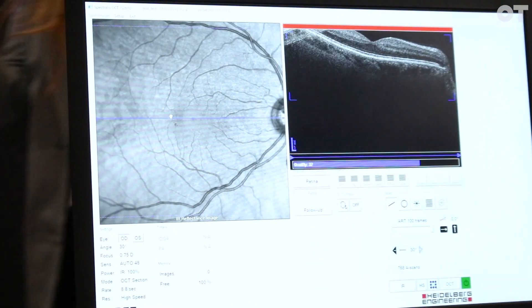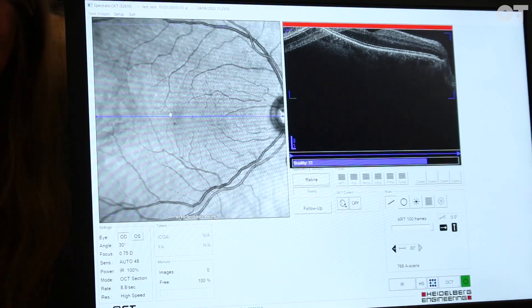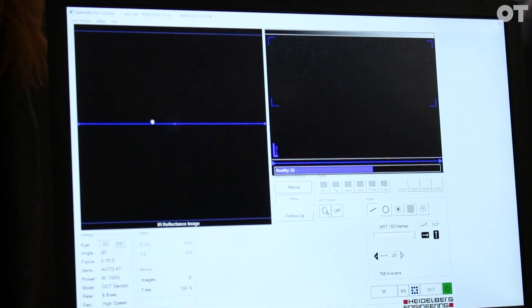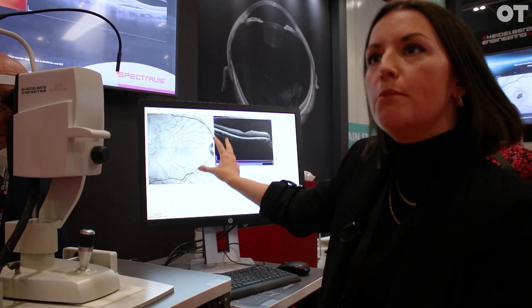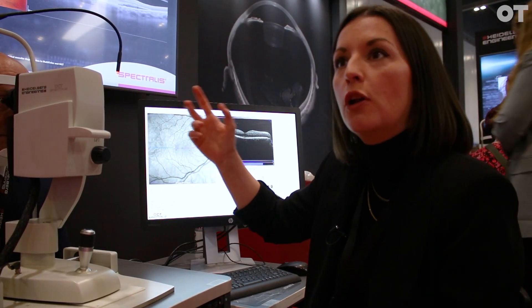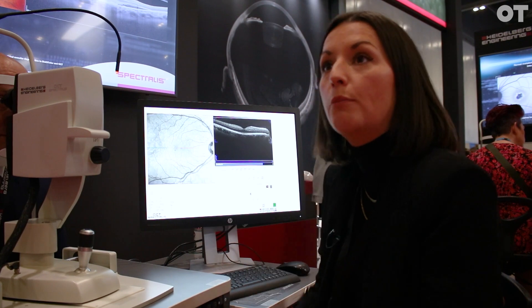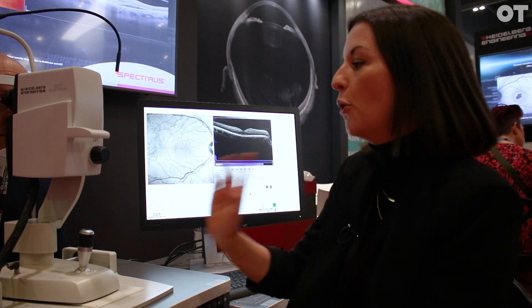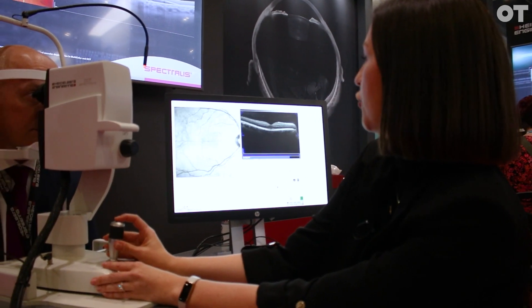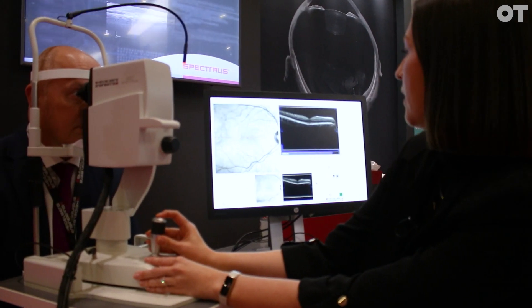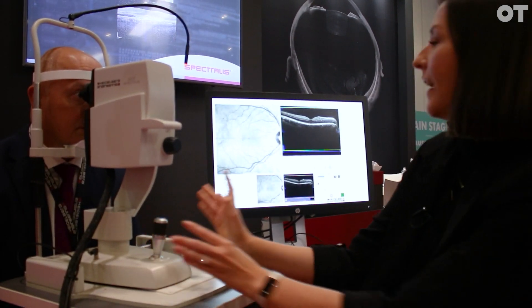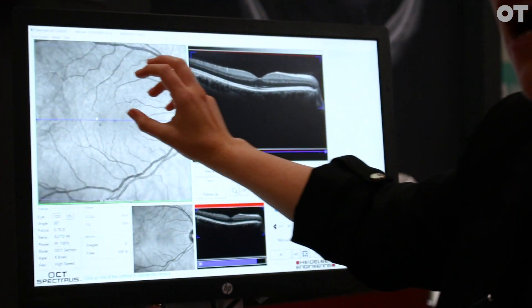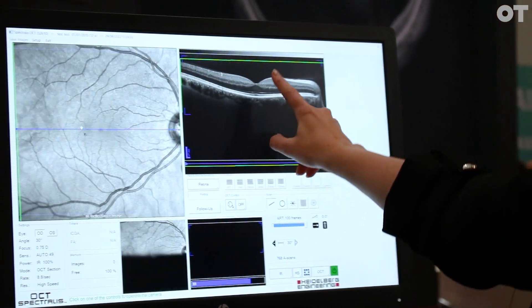What's really nice about it being live is if I see anything I'm a little bit concerned about or want to scan, I can literally just point and click. You can see at the moment the images are moving around a little bit — that's just because my colleague's eyes are moving, normal microsaccades, blinking as normal. But what I can do is just hold down this joystick button and that engages my active eye tracking.